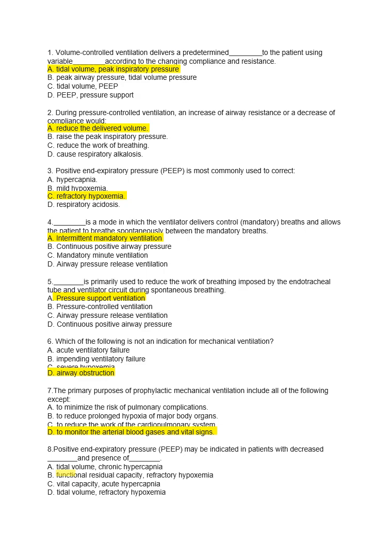Today we'll be discussing the questions and answer key to the series of ventilator videos that we have already uploaded.